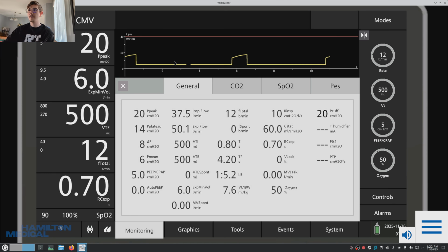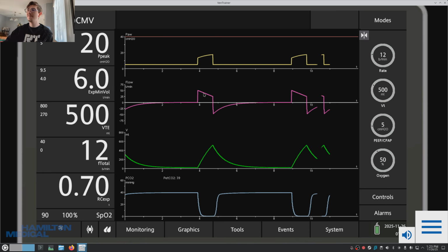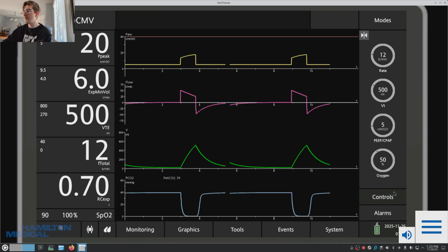But let's look. Okay, our airway resistance, exactly the same. Our driving pressure, exactly the same. Our static compliance, exactly the same. The only thing that's changed is how it looks. And this might maybe be more comfortable for the patient because it does kind of mimic a little more how the patient actually breathes.